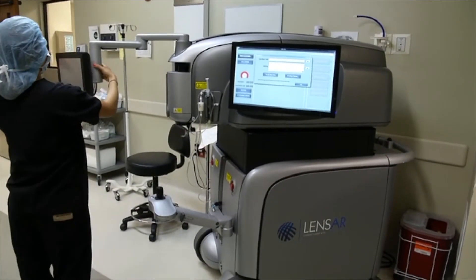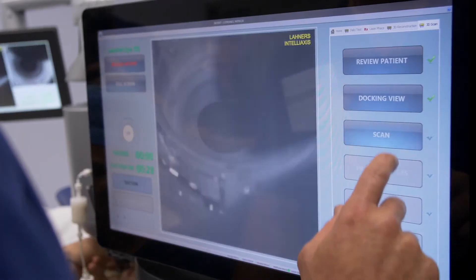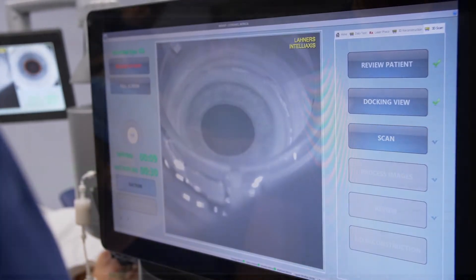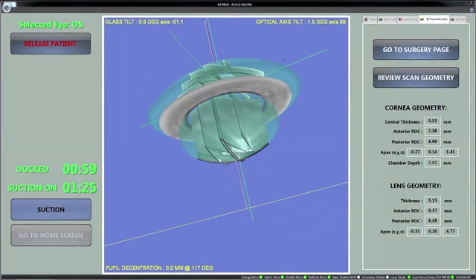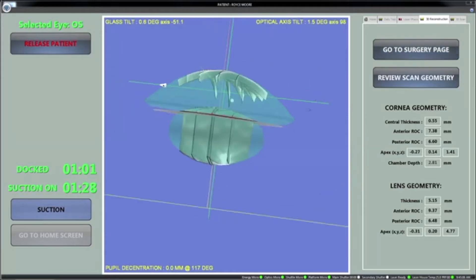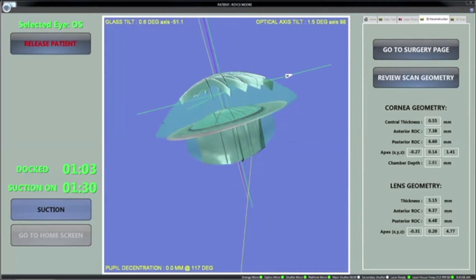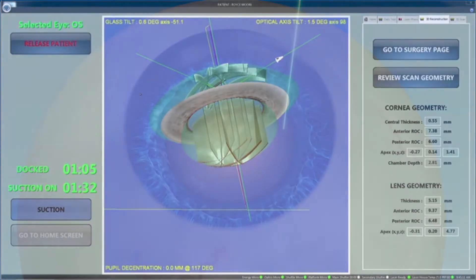Opting for a laser cataract procedure with the advanced features of the LensR Laser System provides more precision and accuracy during the critical steps of the procedure. The LensR Laser System's advanced augmented reality technology is a unique imaging system that provides your surgeon with a 3D view of your eye, allowing for more detailed information and treatment choices during your cataract removal procedure.